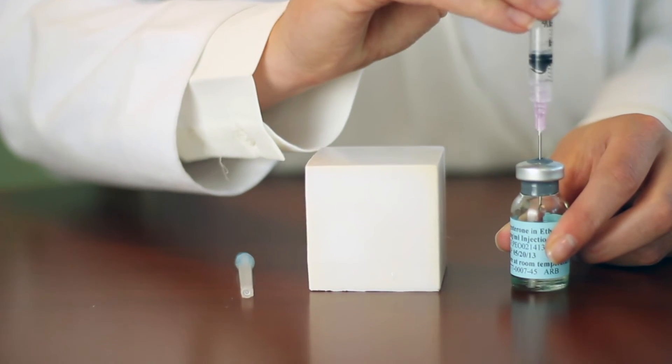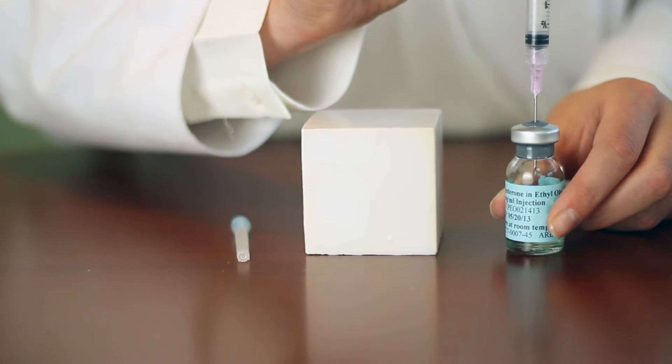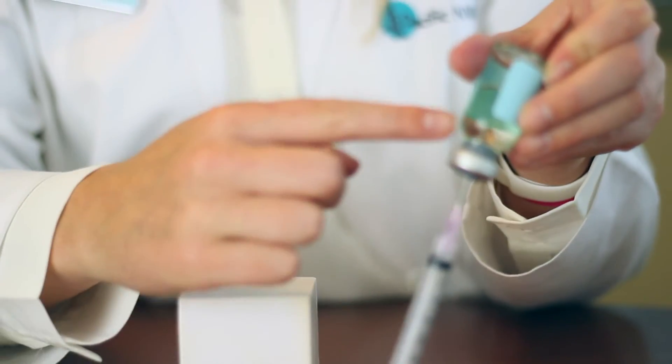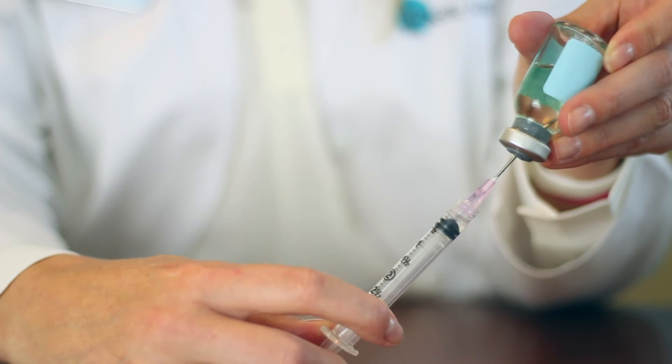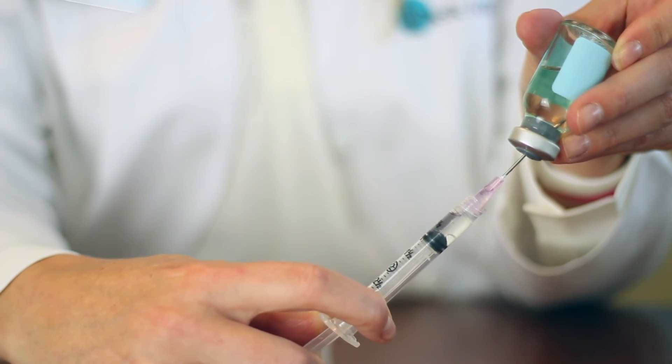Inject the air into the vial. Flip it upside down so that the tip of the needle is submerged in the progesterone. Draw down to your dose.